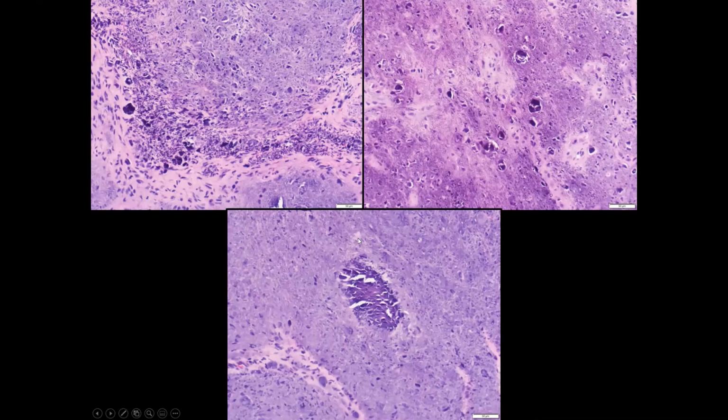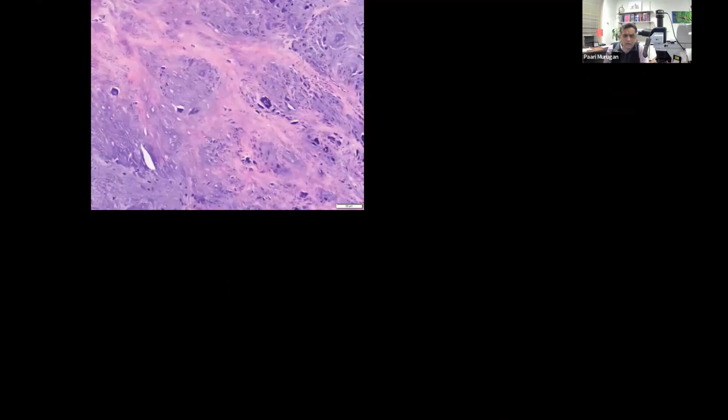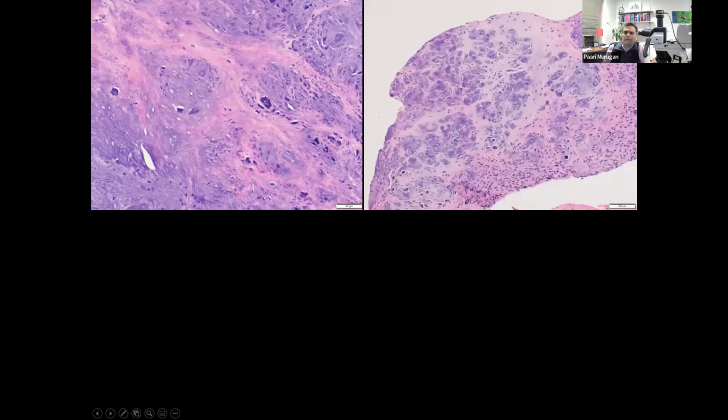And then in some areas, we could see that the calcification actually congealed to form some larger structures in the tumor matrix. There were other things that were seen in the resected specimen that were not quite obvious on the biopsy specimen, like this area, for example, where you seem to have some pink matrix that was almost osteoid-like in combination with the blue granular substance.